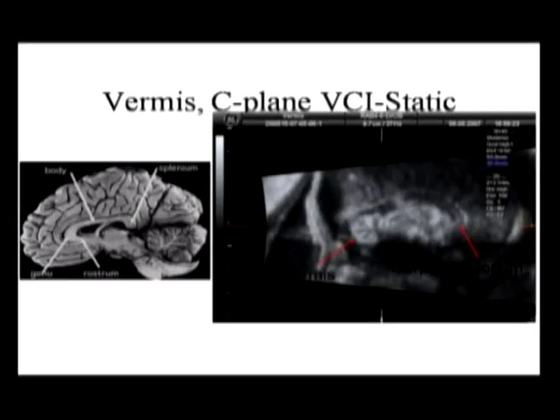Suppose an organ like the corpus callosum, that is actually the connecting part between the two hemispheres. We have two hemispheres of the brain. That connecting part, if it is absent, the baby will have severe mental retardation and problems like that. So just to see the corpus callosum, 4D gives an excellent technology, and 4D gives you an excellent plane like this and shows the corpus callosum there.